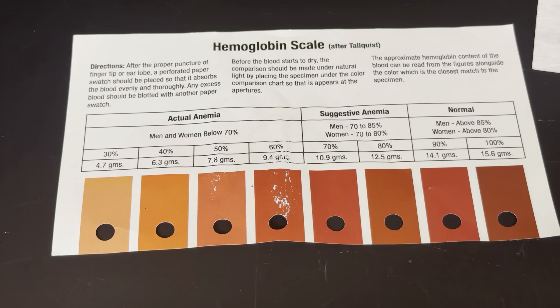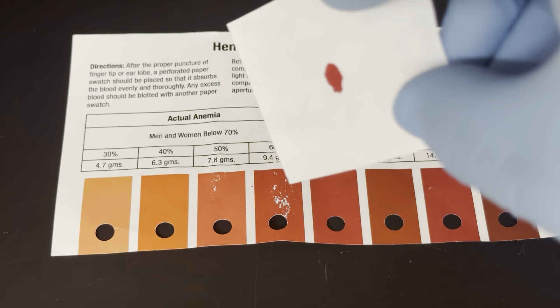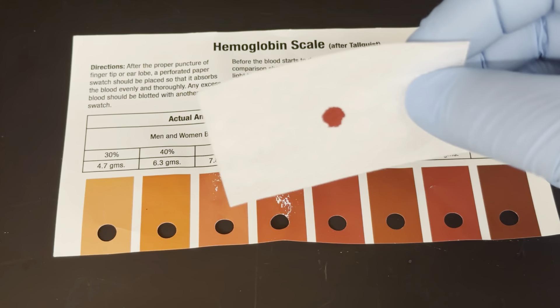The way this test operates is, as mentioned, you need a little bit of blood, which your professor will provide. I'm preparing some blood right now off screen. There's our spot of blood. The blood needs to absorb into the paper first, which it looks like it's done. It doesn't take very long.